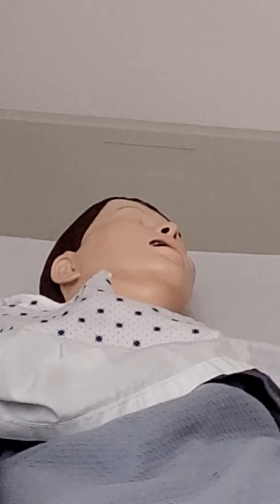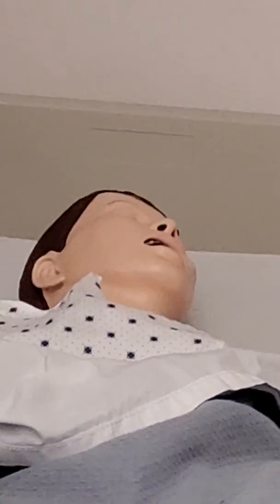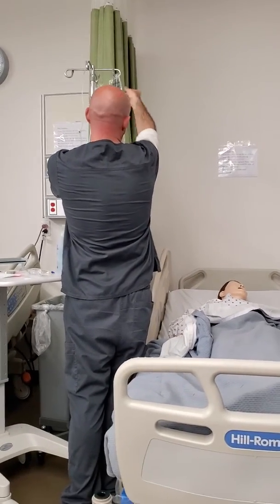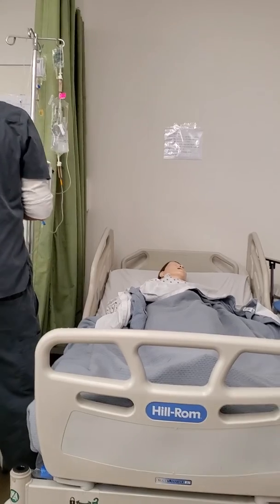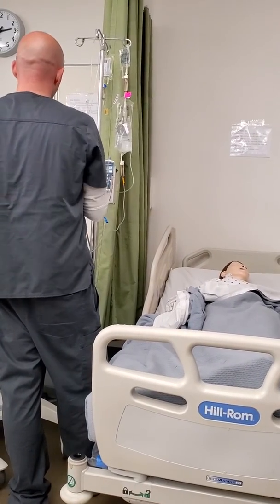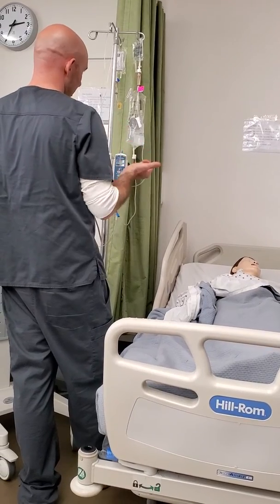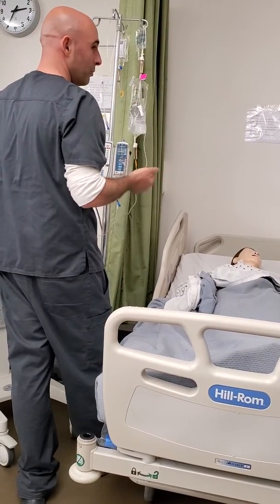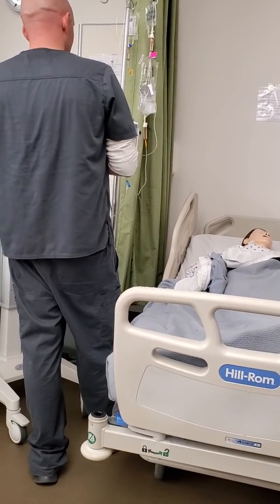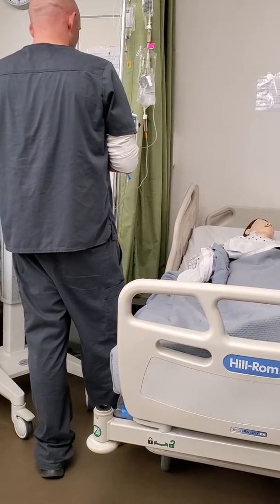So this would be Ancef. It was empty. There is no label on the empty bag. For when it was hung, I should know that. So I'd have to look on the computer to see when it was last hung, which I did when I was in the med room. But I come in and double check because it doesn't hurt. It's empty, and I check that.